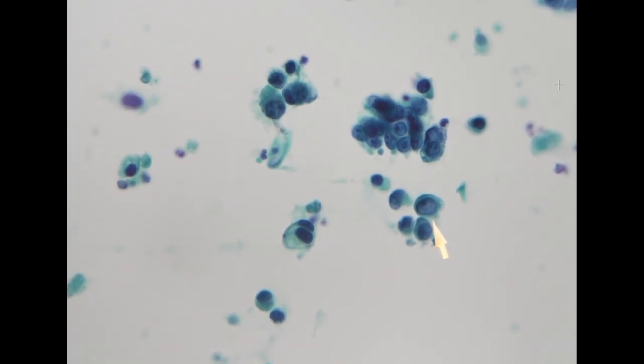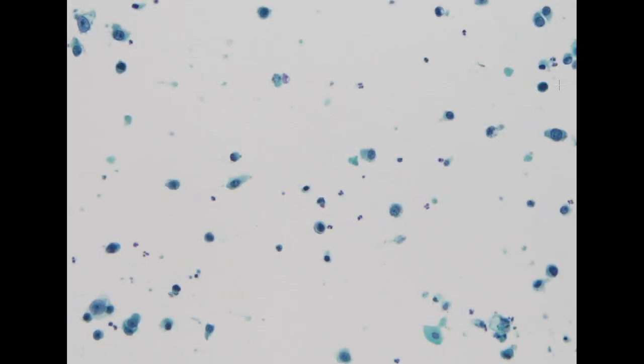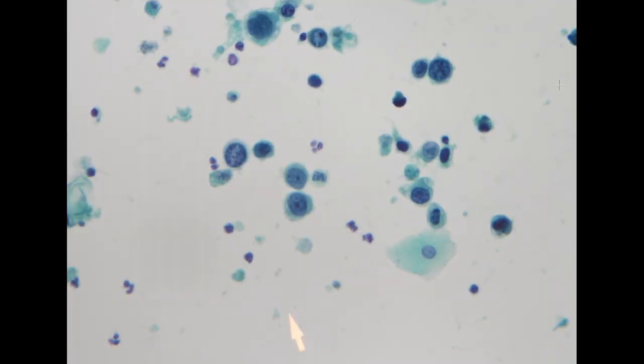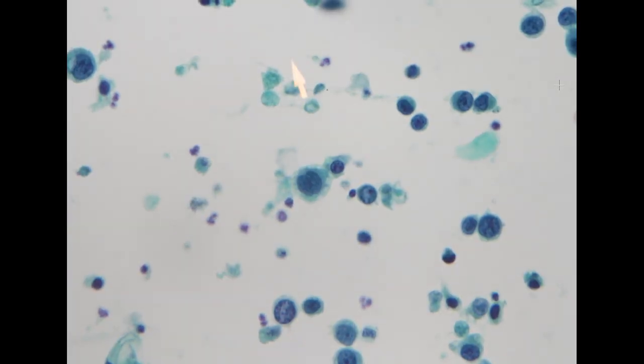Some of the cells show a hypochromatic pattern, but with scattered coarse chromatin. So this is also positive for high-grade urothelial carcinoma. And in the background, we can also see some necrotic cell debris as well. So this is positive for urothelial carcinoma, high grade.